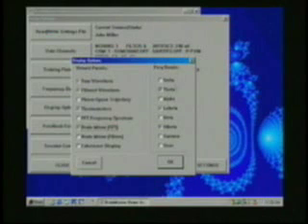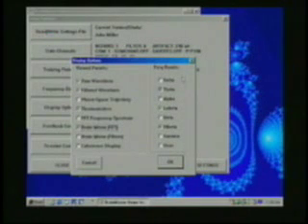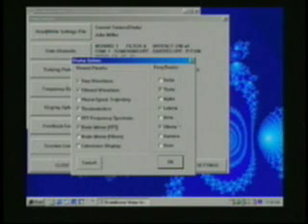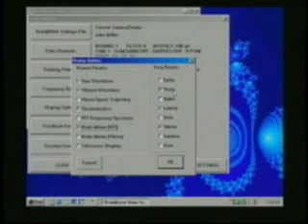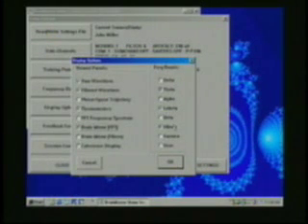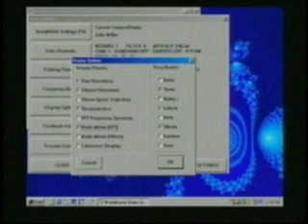And then on the right, you see we have the frequency bands which are viewed. This picks which components are going to be displayed. So we're going to look at the theta, the low beta, and the high beta. We could look at other components whether they're trained or not.